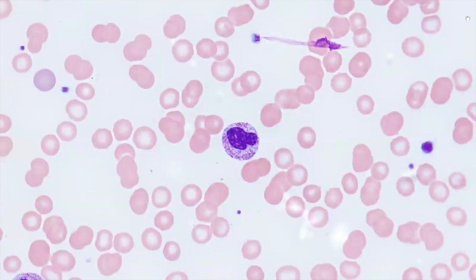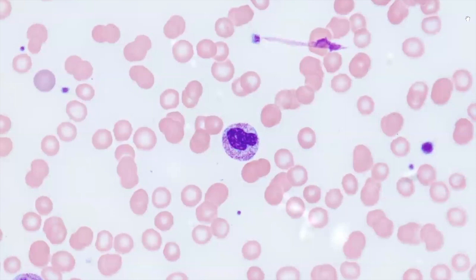Döhle bodies are generally associated with toxic changes, such as toxic granulation and toxic vacuolation, in conditions such as infections, burns, trauma, and G-CSF. Döhle bodies without the accompanying toxic granulation and vacuolation are seen in cases of May-Hegglin anomaly and can sometimes be seen in pregnancy, myelodysplasia, and post-chemotherapy.